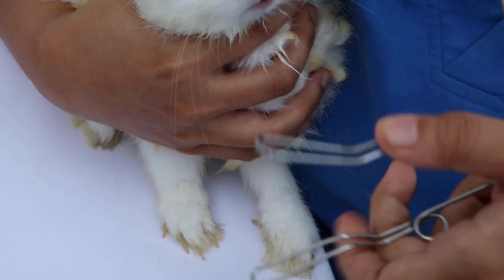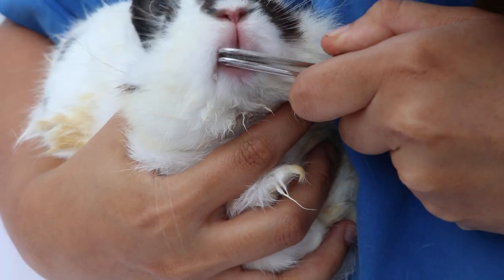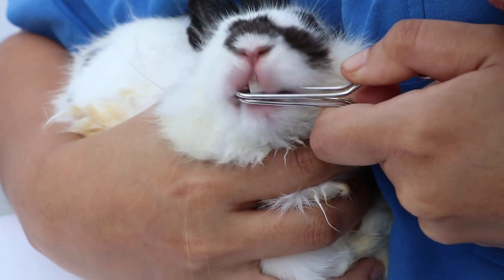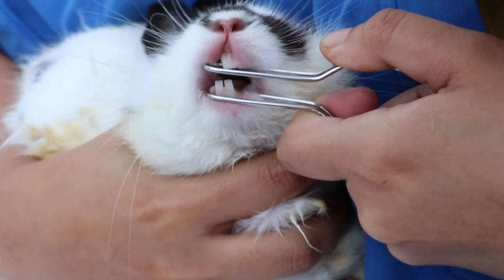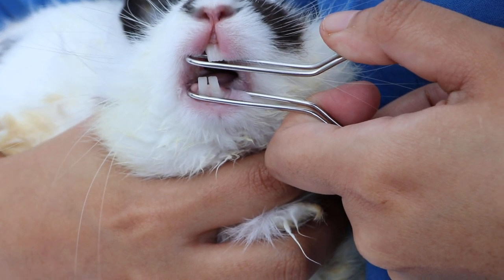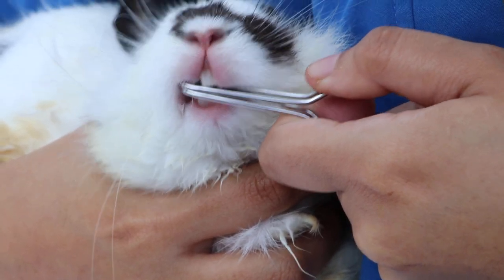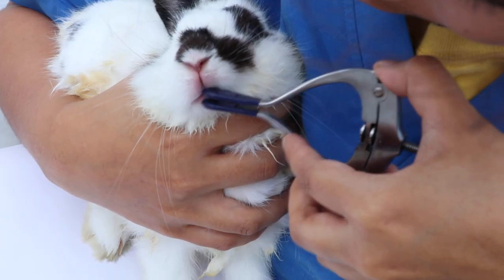This is the wire mouth gag, used to open the mouth. It is inserted in the incisor — upper and lower — as shown here. Then open the mouth vertically.